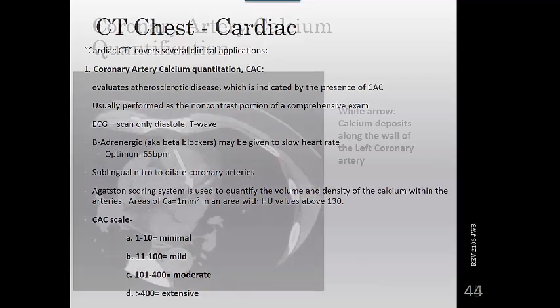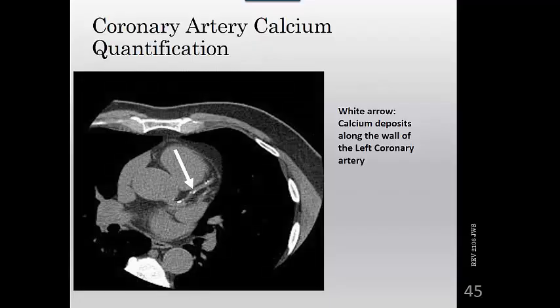So this image here is a typical slice through the left main coronary artery, and you can see the calcium deposits within the artery against the walls here and here. A stent would look totally different. It would kind of cover the whole artery. But what you have are these calcium deposits here and here, up here and down in here in this left main coming off.